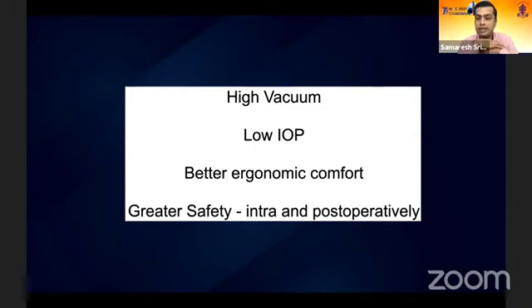So, while senior surgeons can get away because they've learned with experience, early surgeons should go slow on their machines. And of course, with these newer machines, there is so much greater safety, and like I was saying in Dr. Naren's talk, it's the early surgeon who needs to adopt a better machine because that will make the surgeries far more predictable. So good, experienced veterans can do away with even poorer machines.